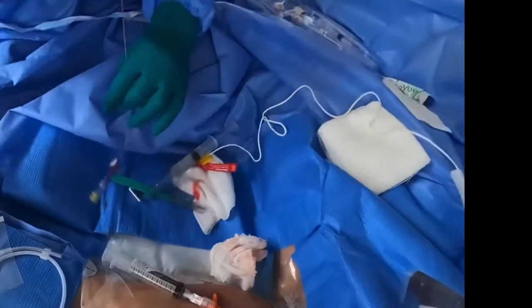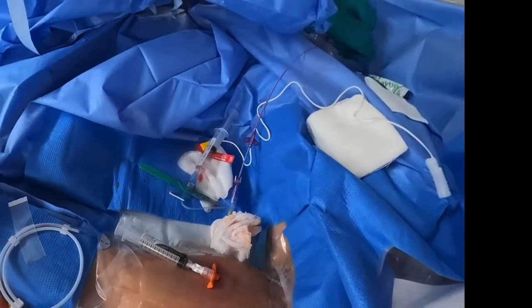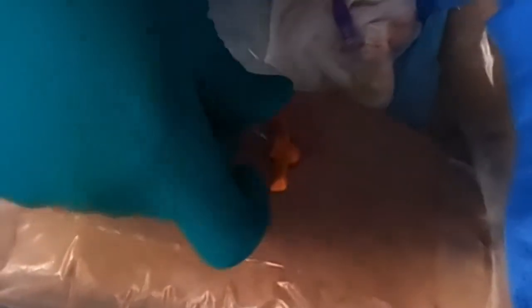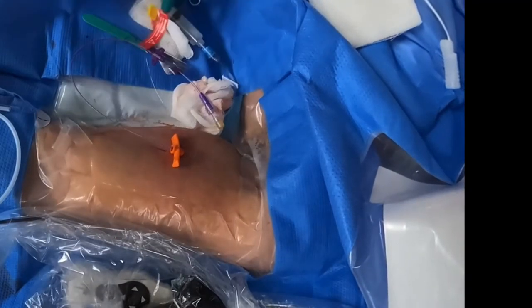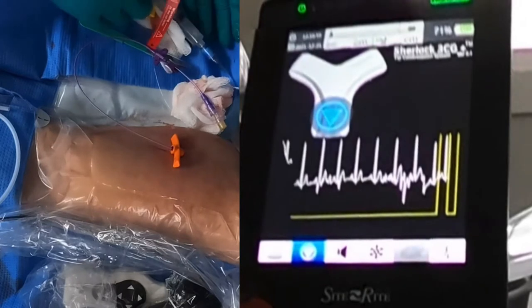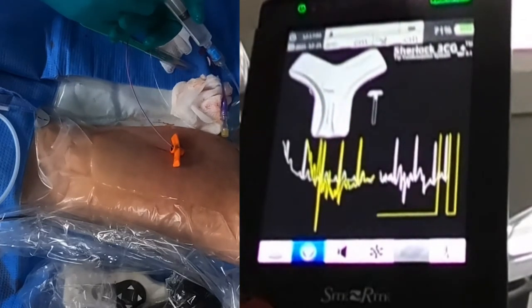Cutting the catheter up to 46. I like to give it a little wet — that way it goes nice and smooth. There it is. We're going to give it a flush for the 3CG to be able to come in contact with the saline and the stylet on the inside. Of course we're going to recalibrate. Look at that beautiful wave — nice prominent P-wave.